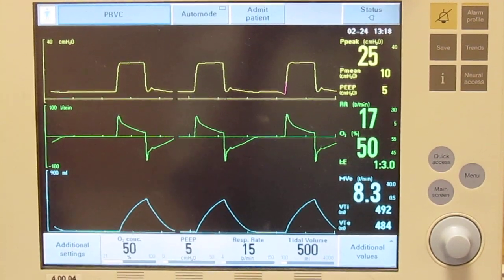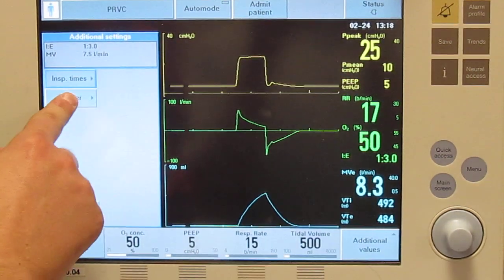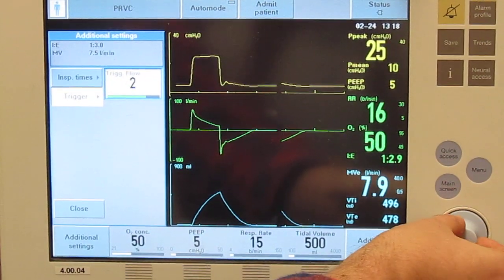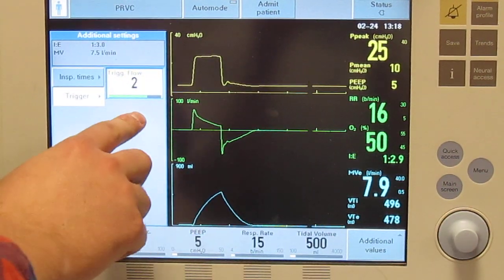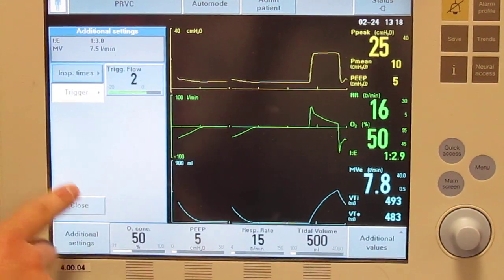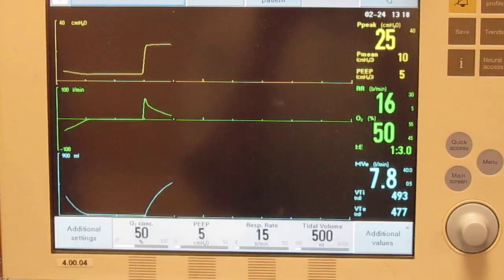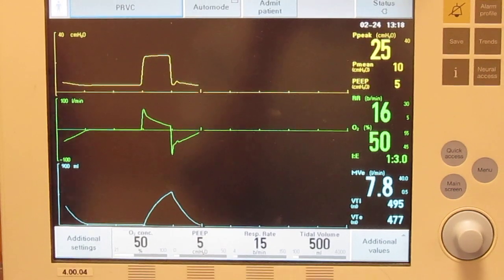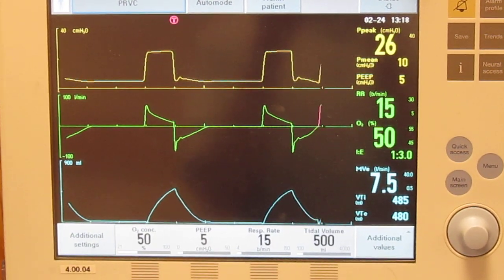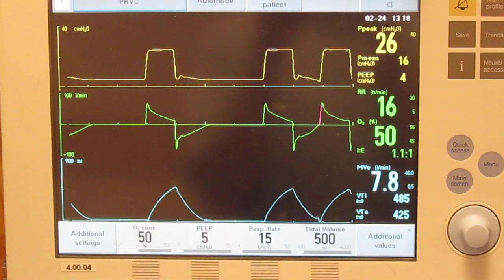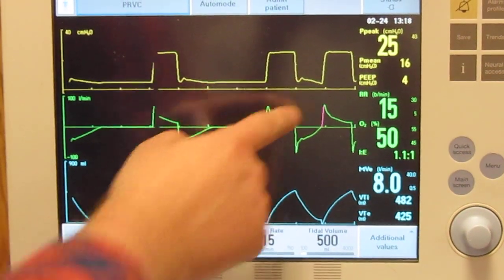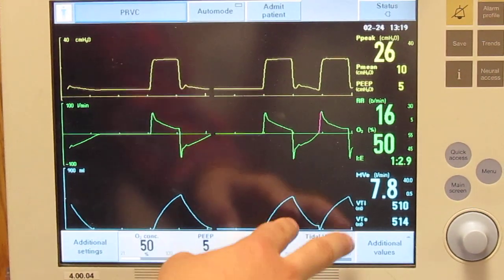We'll try flow trigger right now. We go in and change it — flow triggered at two liters per minute. You shouldn't see the negative deflection now. After this breath, you should look back every time and be looking for it. It just looks like any other breath. Same volume.